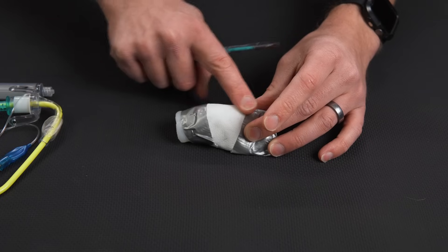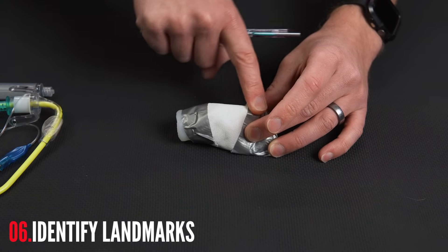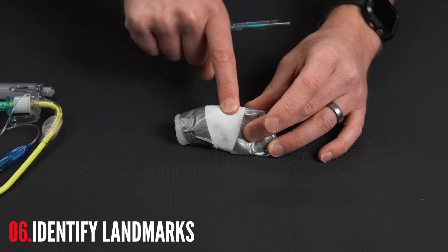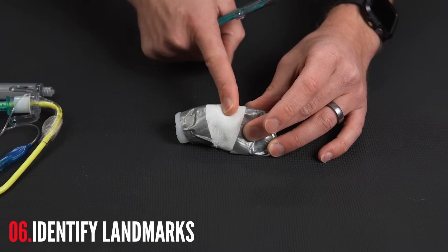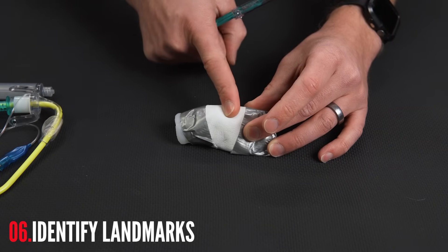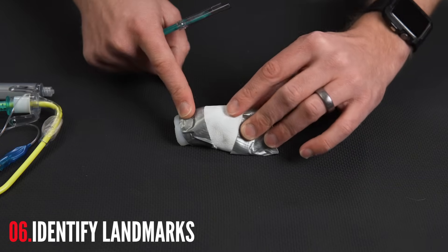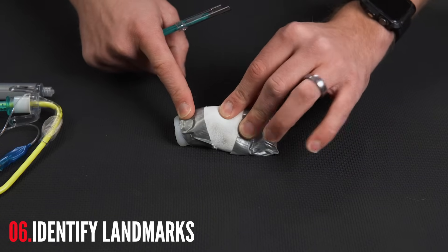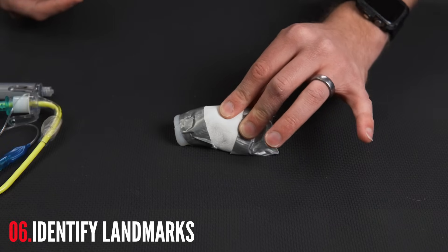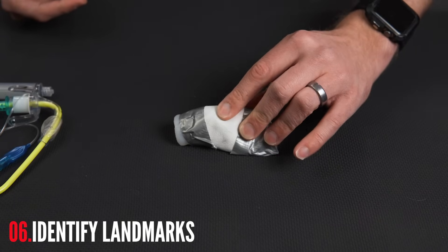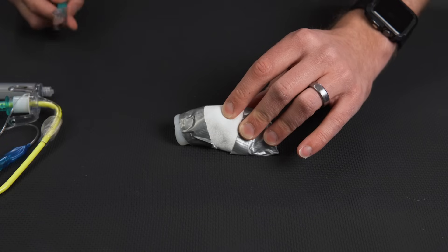I'm going to come up here. I can palpate my landmarks, make sure I have my prominence here, the Adam's apple. And then I come down and I can feel the actual cricothyroid membrane here. And that's where I'm going to cut. So this pointer finger can save my spot. These two fingers are making sure nothing moves. This finger is confirming where I'm at.